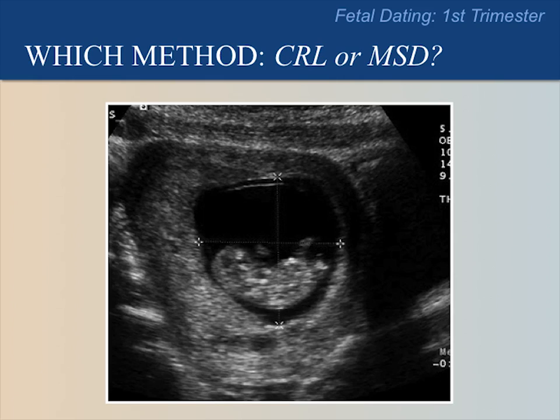Now consider whether the fetus is in an ideal position for crown rump length measurement. Pause the video now to encourage responses.